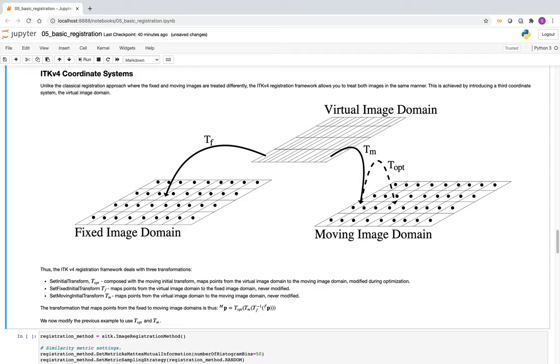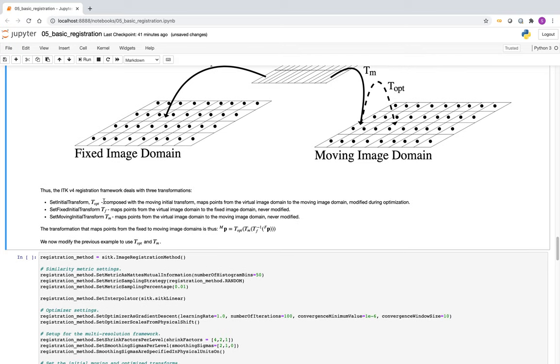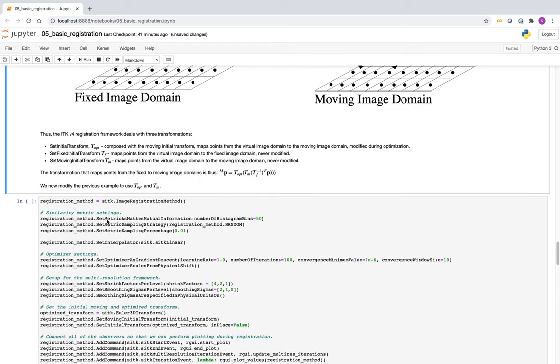With the ITK v4 coordinate systems, the virtual image domain was introduced. We have a transformation that maps from the virtual to the fixed domain, from the virtual domain to the moving image, and the optimized transformation which maps from moving back onto itself. By default, the virtual and fixed image domains coincide, so TF is the identity. TF and TM are not modified during optimization — only Topt is modified. SetInitial is what will be modified; SetFixed and SetMoving are not changed during registration.